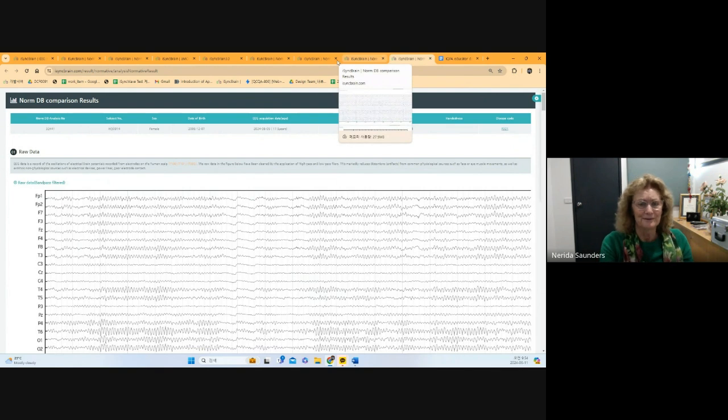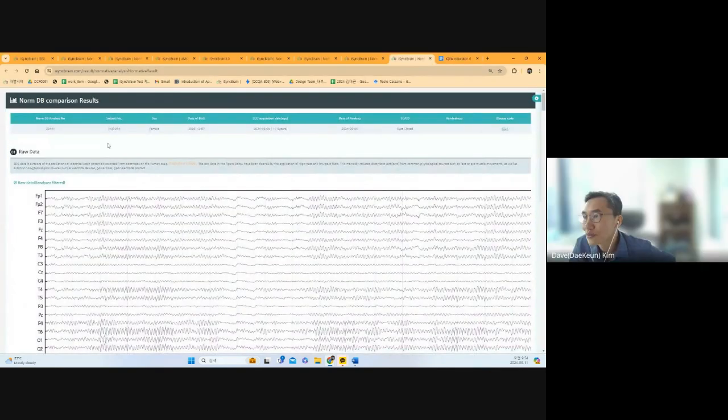It's beautiful. So I think that's the early screening of the MCI using the simple scan, and once we can find the MCI people, we can start speeding up their temporal theta and global slow rhythm using the PBM, and then monitor their progress.